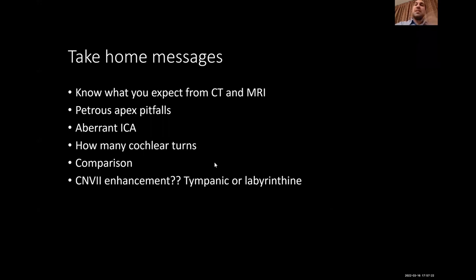Non-nodular enhancement with a long history is Bell's palsy. Differentiate between the requirements for assessment of cochlear implant. CT is very good for the jugular bulb, in the dehiscent jugular bulb. MRI is very good for schwannoma. CT can assess widening of the internal auditory meatus, but MRI can assess the lesion in the cerebellopontine angle. In the petrous apex, MRI is very important and very helpful.